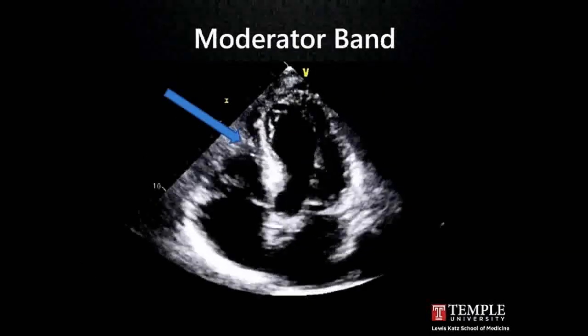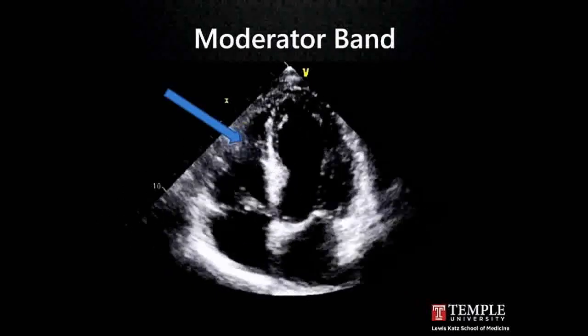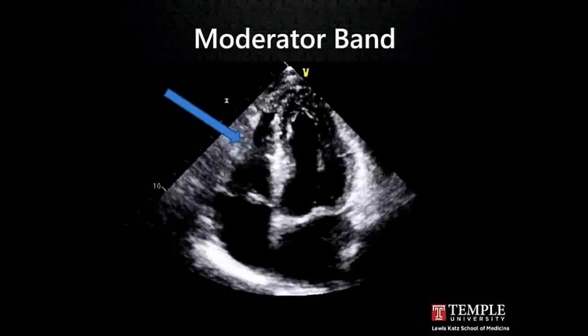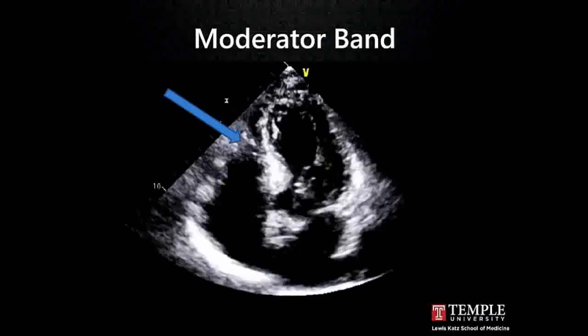Moderator band. It's a muscular structure that's more likely related to maintaining geometry of the RV rather than being functional, but also has electrophysiologic issues associated. But it's, again, a normal structure, and I won't spend much time on this because I think everybody in this room has seen a moderator band.